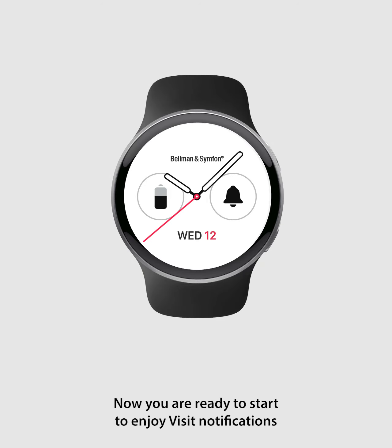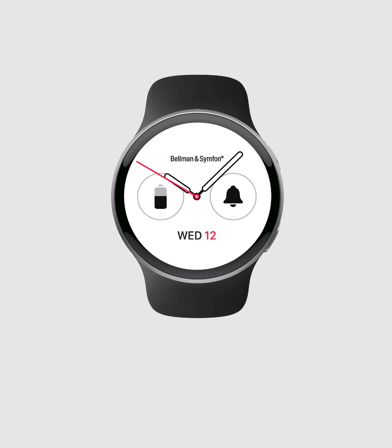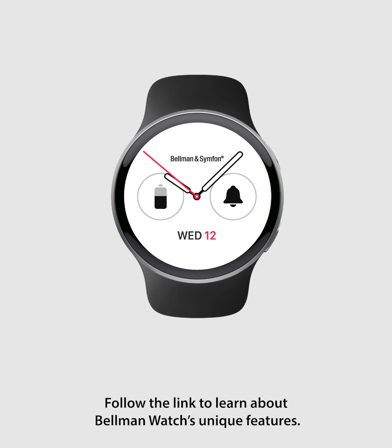Now you are ready to start enjoying visit notifications on your Bellman watch. Tap the screen or press any button on your watch to return to the home screen. Follow the link to learn about Bellman watch's unique features.